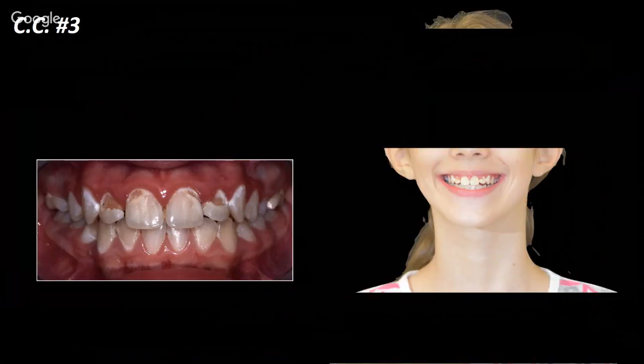So one more time, so important, the right diagnosis, not only for our treatment plan, but in particular in this case for the follow-up. Because if they are just cavities, I'm gonna prepare a kind of follow-up program. But if she's having a very hard treatment like chemotherapy, my follow-up plan, of course, is gonna be different.